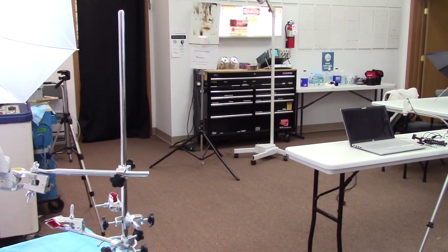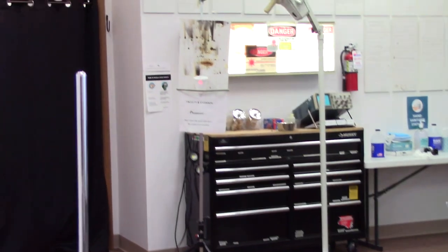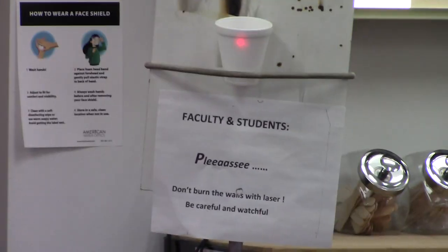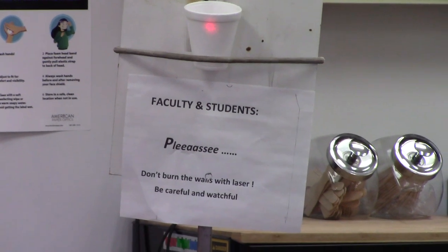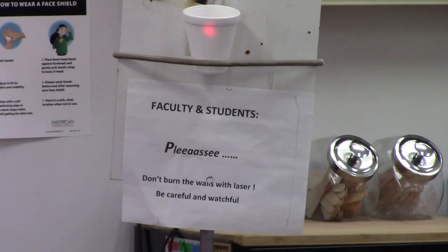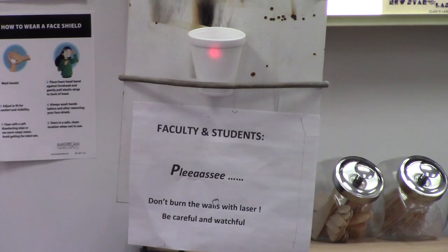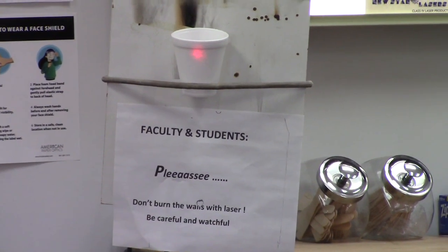Here we've got the beam coming out, going across the room, and I've got it headed right over to that board with a Styrofoam coffee cup on it. You can see the red guide light on it. Let's focus on that and then hit the laser and see what happens.